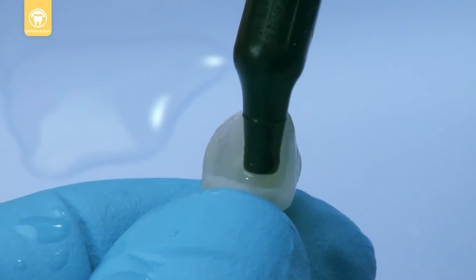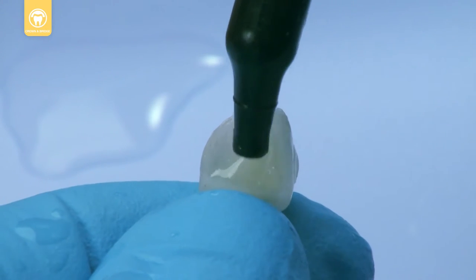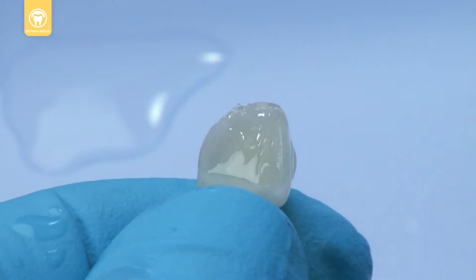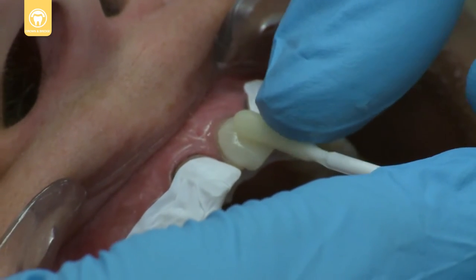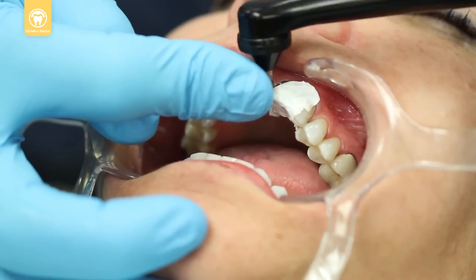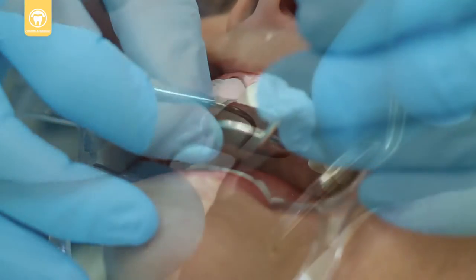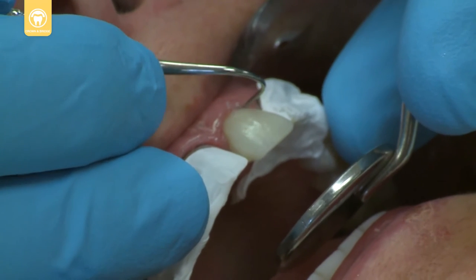Next, express a thin layer of PermaShade LC onto the inside bonding surface of the veneer. Carefully position and seat the veneer using gentle pressure. Tack cure the veneer with the Velo curing light for 2 seconds to avoid shifting. Clean the excess cement from the margins and place Deox if desired.